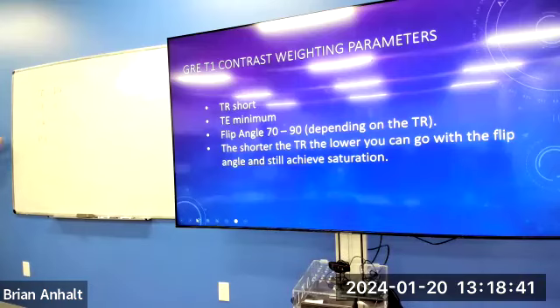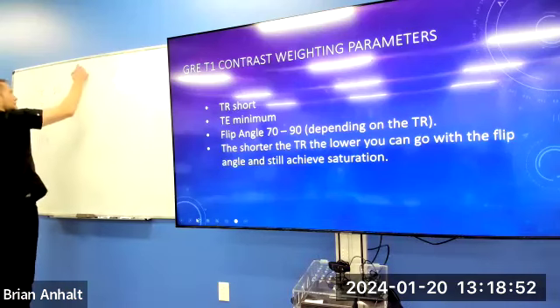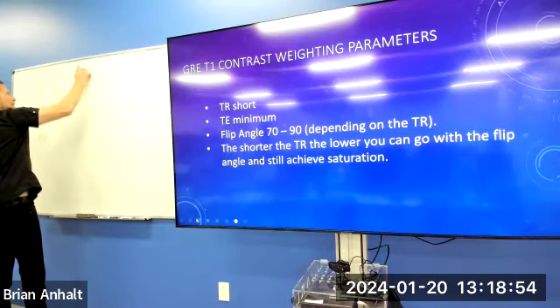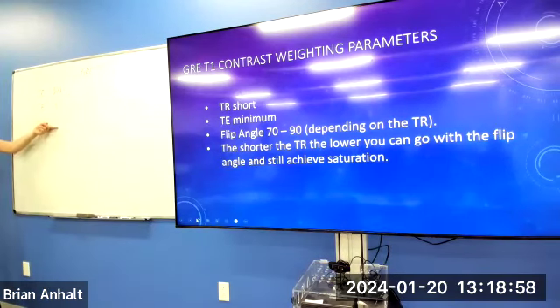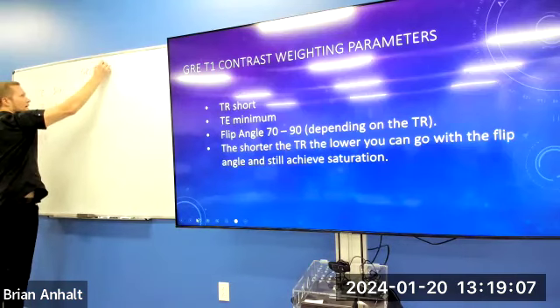High flip angle. I am going to saturate tissues with a long T1 recovery time, right? We know we don't have a refocusing angle, so what type of sequence is this? Gradient or pulse or spin echo? It is a gradient echo sequence, right? With a high flip angle and a very low TE. What kind of weighting do I get? T1, right? This is a T1 weighted gradient echo.